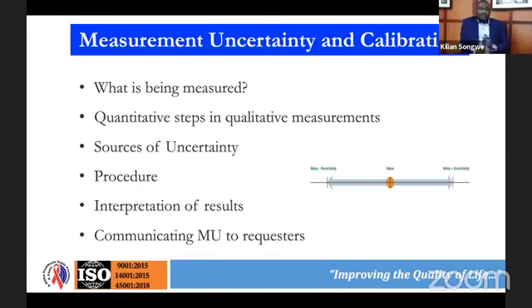So, like we said, Prof talked about measurement uncertainty and what exactly this is. You are just establishing the degree of doubt that you have about the assay result that you're releasing. So if you release a result, let's say it's a CBC done by a certain equipment X, you want to establish and say, whenever I release a result from this equipment, this is the degree of doubt, this is the range of results where the actual result will fall.